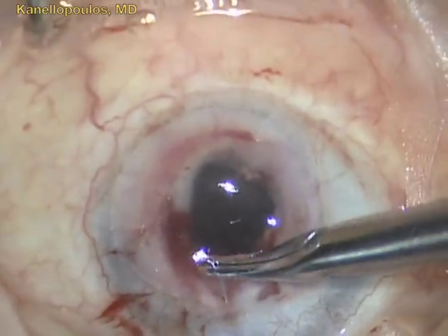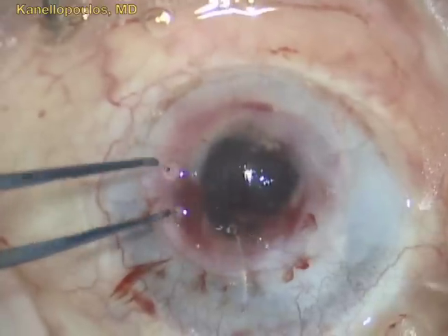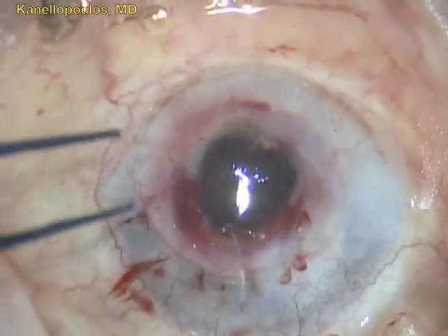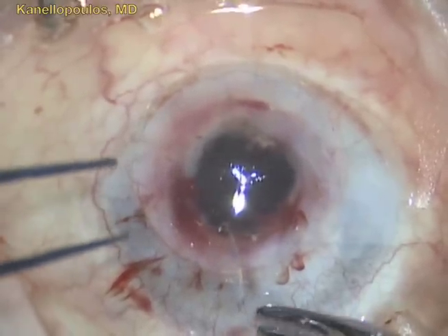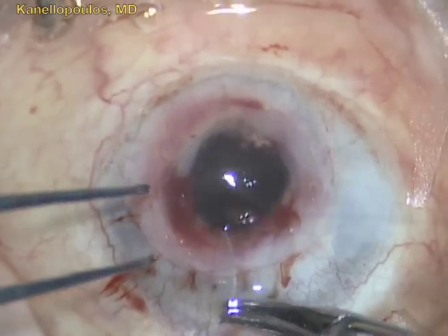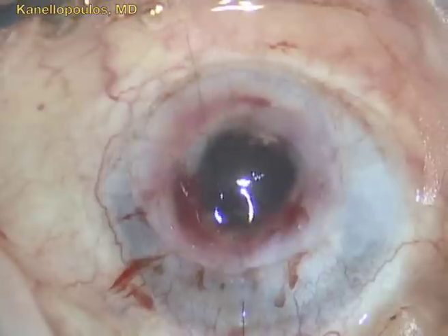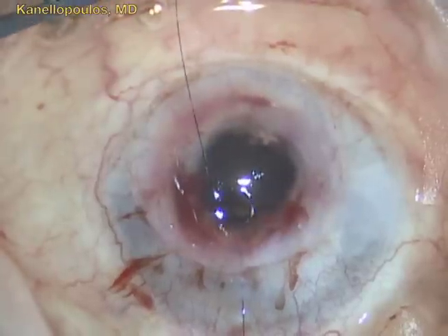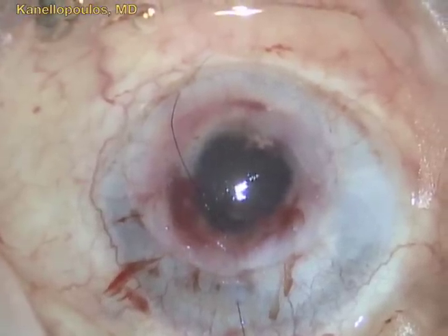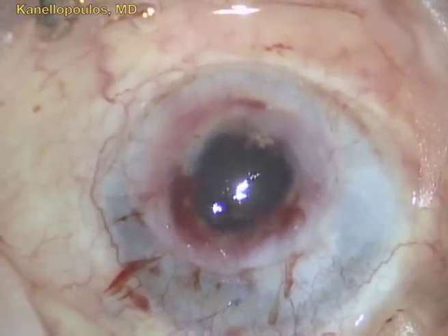Here, the first suture — the 12 o'clock suture — to start the process. We use 10-0 nylon interrupted sutures here because the host bed is slightly vascularized.